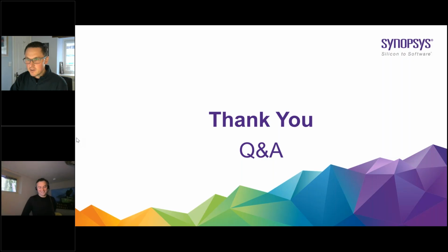So starting at the top, how to get hold of the academic package, and does it include NURBS, are two questions. Yeah, so you contact us, Simpleware at synopsys.com, and we can put you in touch. Simon is our academic account manager. It currently does not include NURBS. Hopefully that will be resolved shortly. So for customers who need that, you can get our typical academic software package. That's no problem. It isn't 50 licenses for $1,500 per year. But we've been doing some short-term licensing to bridge that gap for when we eventually do release it.